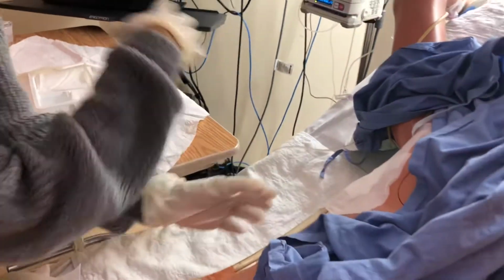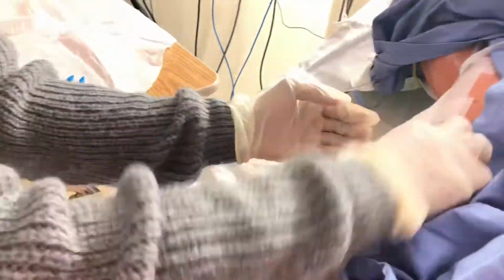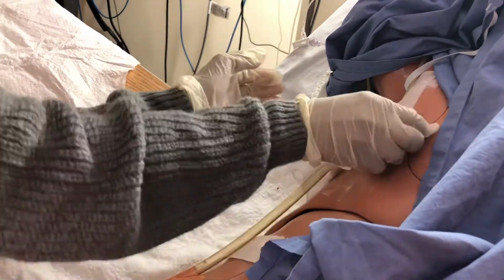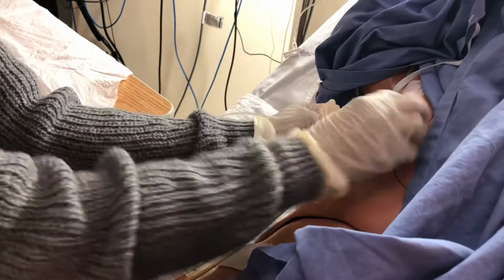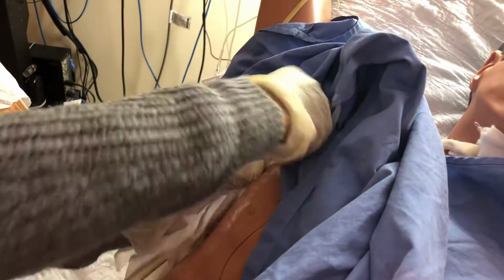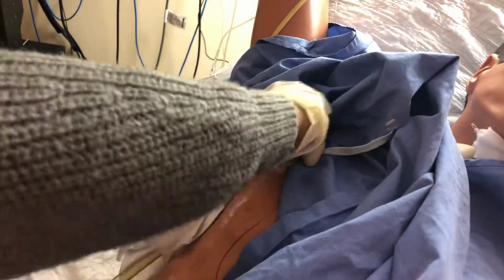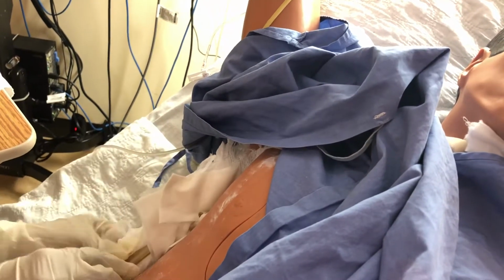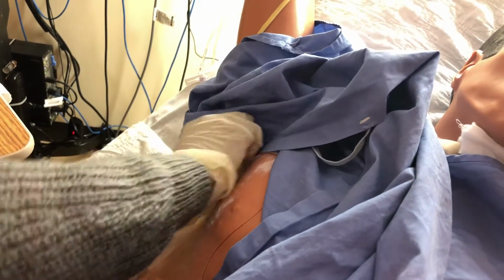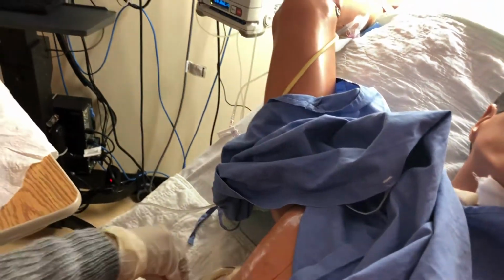So ensure not to cross my field. I'm going to take out the old dressing. I already checked, there is no drainage. I'm gonna quickly take this out. So I'm gonna make sure that it's not dislodging from here. Okay. So yeah, there's no redness or anything. Okay. No drainage. Everything's good.